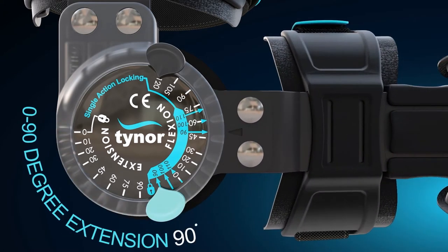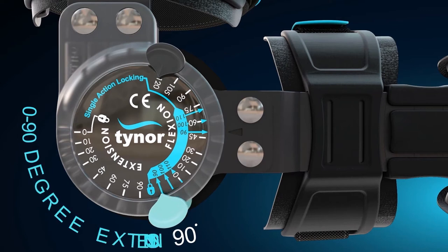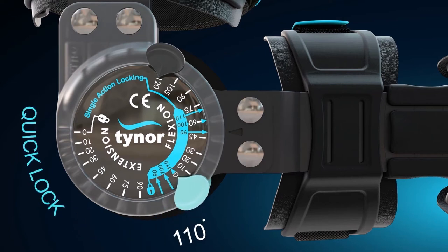An extension from 0 to 90 degrees. This brace can be locked at 90, 100, and 110 degrees for absolute immobilization at any of the three angles.